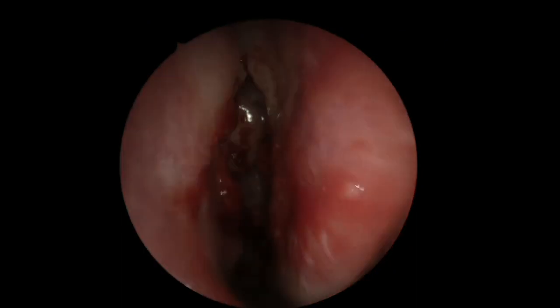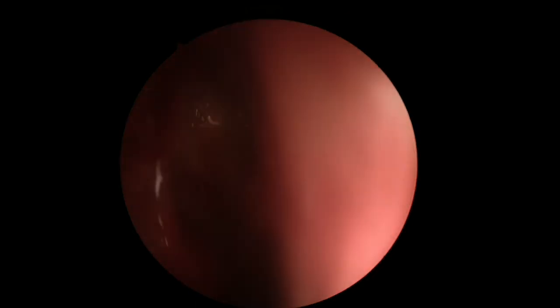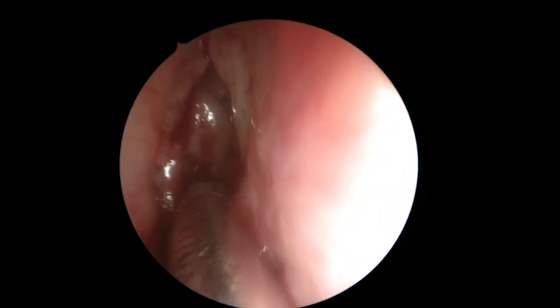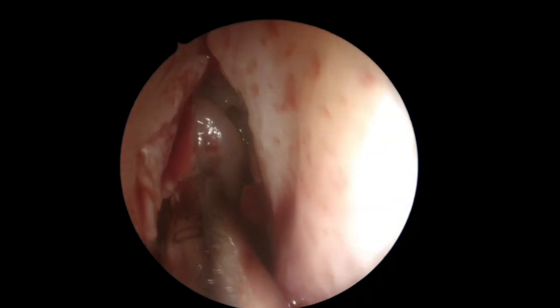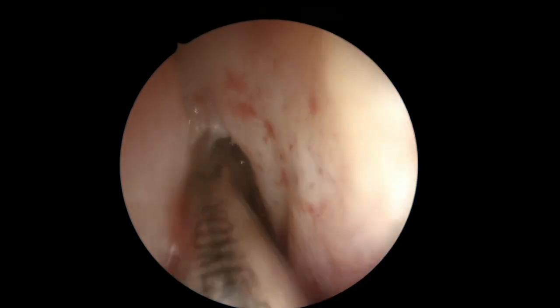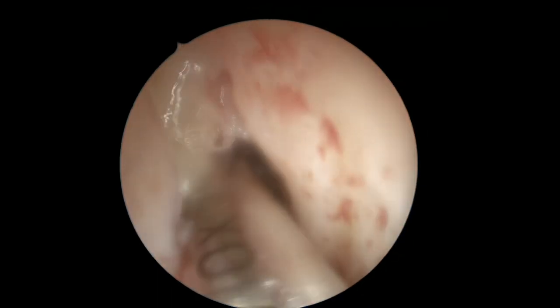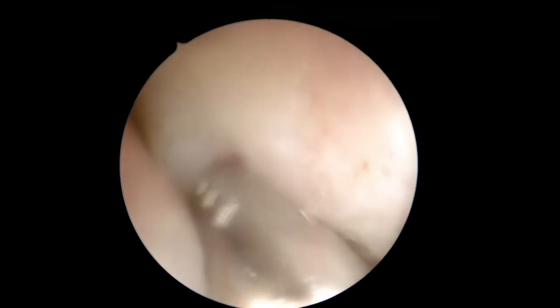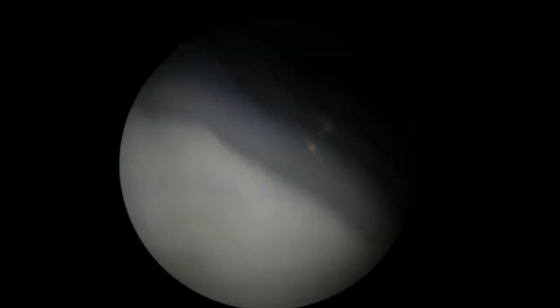In this case I decided not to edit it a lot, so you will see a lot of the processes. I removed all the parts where we just clean the optic and the endoscope, but the rest of it is almost unedited. The complete surgery was about 25–30 minutes.